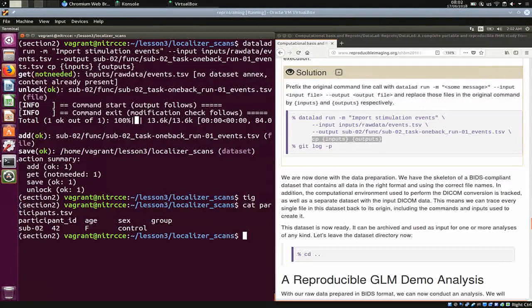Yes, we need a microphone. Where do I find what information? In here, that is because the age and the gender of the subject is coming from the DICOM metadata. So yeah, you encode that prior to the acquisition stage. You register the patient, and then you have to type in the weight for the SAR limits, etc., including the age and the gender. And how about the fact that it's a control subject? I think this is a bold statement by the tool that it's probably a control subject. But these files are editable. You can just go and correct that, and also add all the other variables that are interesting in your particular context, which may or may not come from the DICOM metadata. So questionnaire items, that kind of stuff can all go in there.